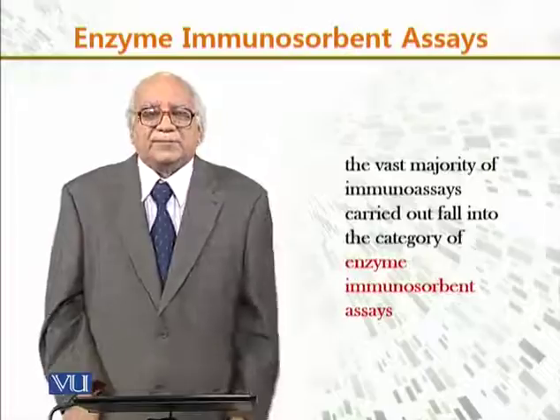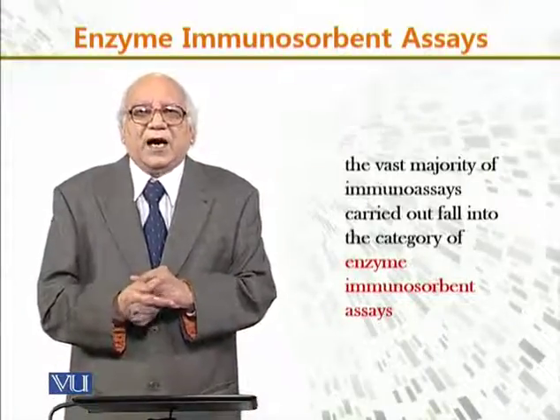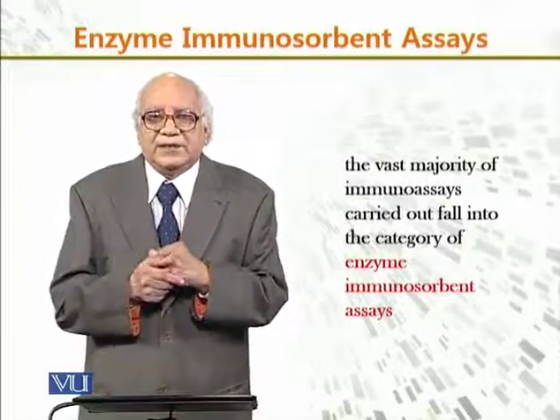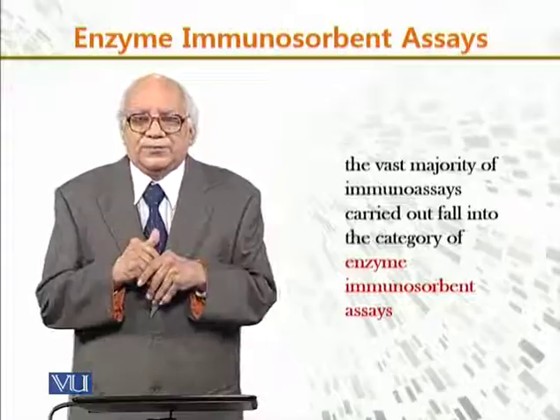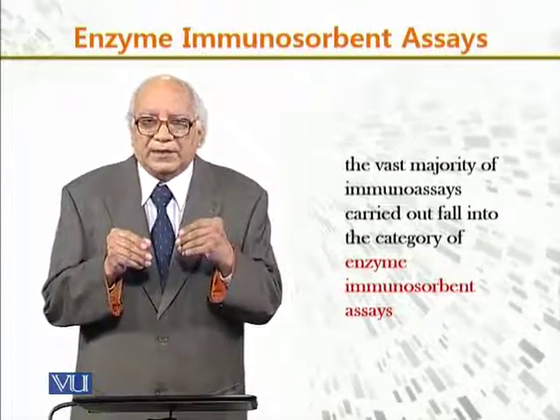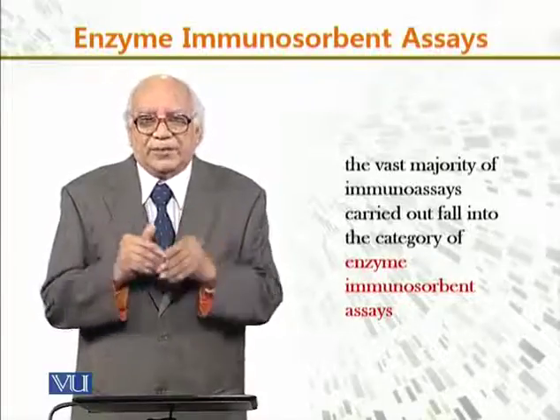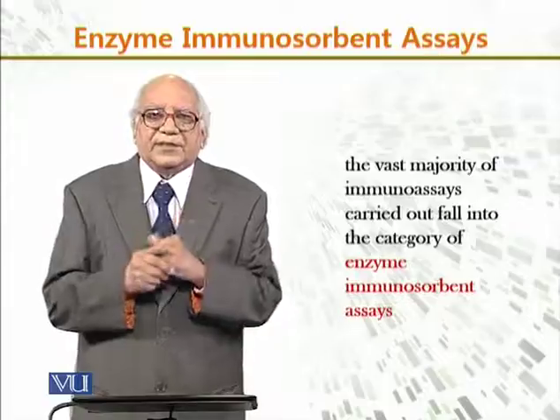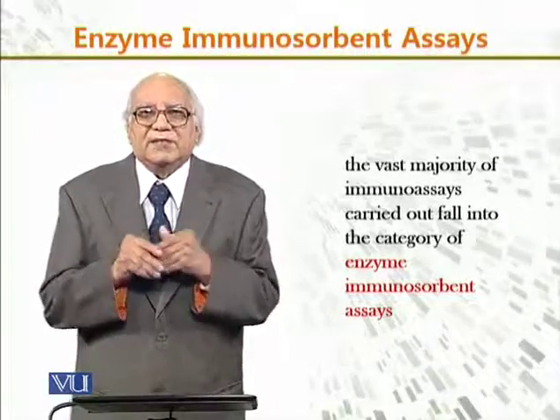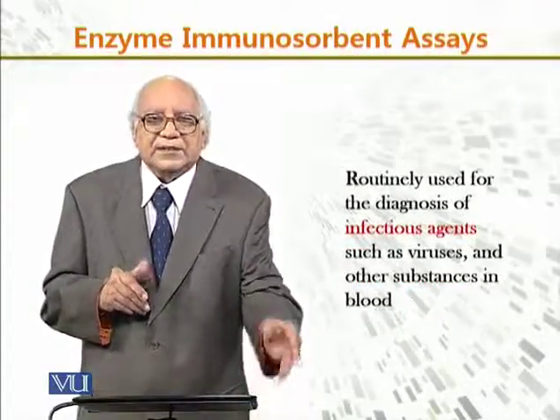Now, the vast majority of immunoassays fall into the category of enzyme immunosorbent assays, the vast majority of methods for assaying antibody concentration.